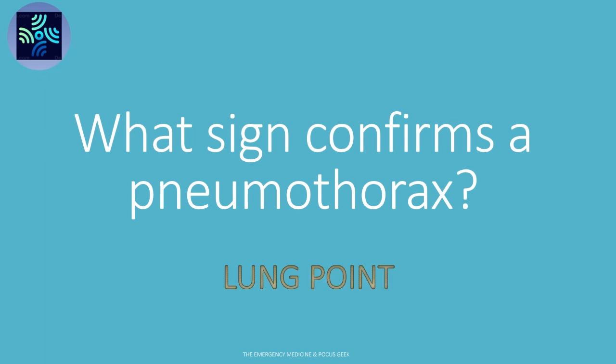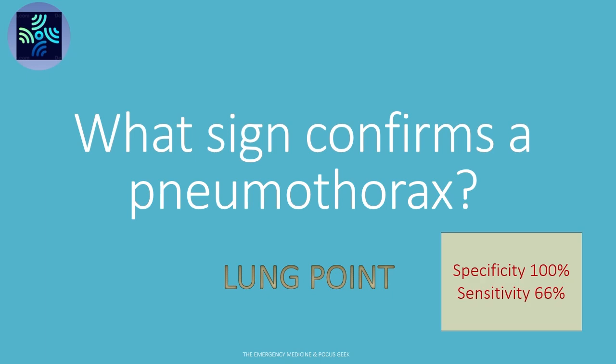Therefore confirms the diagnosis. However, its sensitivity, the ability to correctly identify the presence of a pneumothorax, is much lower, around 66%. This is because in large pneumothoraces, the lungs may be so collapsed that there is no point of contact between the lung and the chest wall.